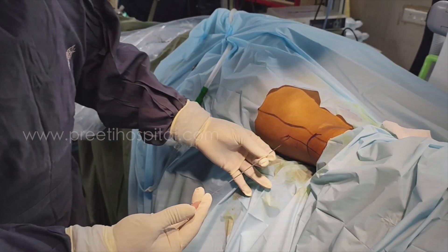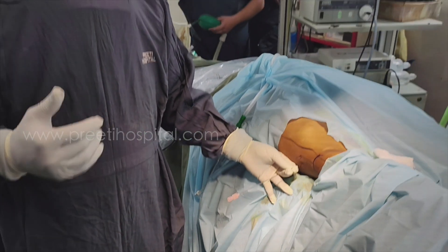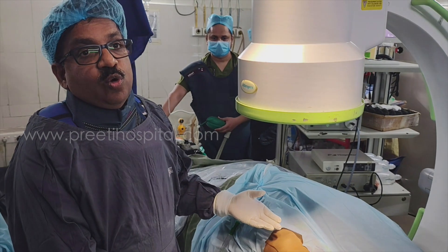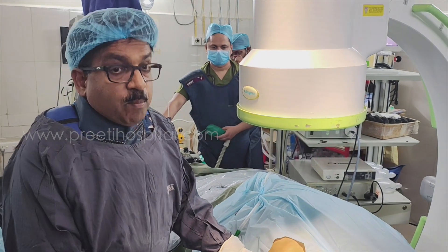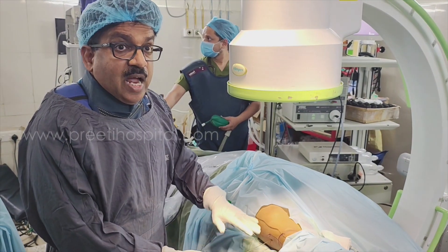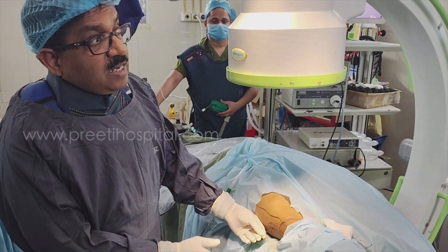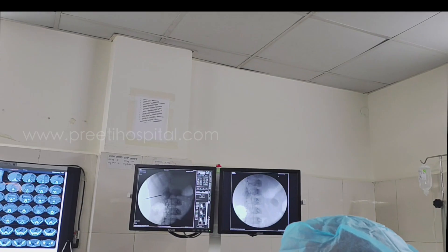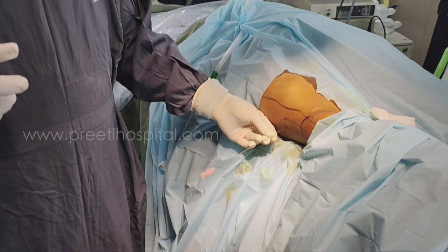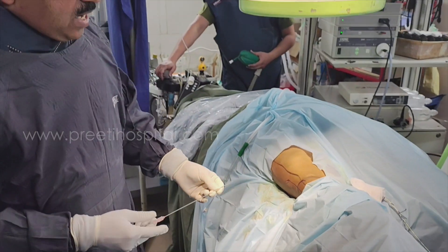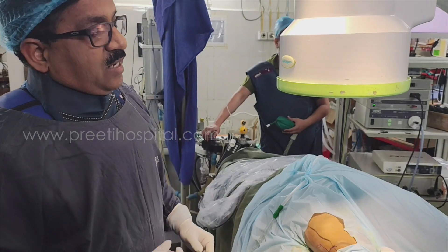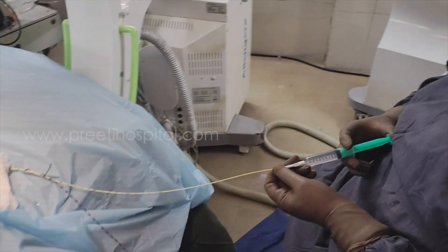Without RGP, you should not do the puncture. Now I have marked and decided one centimeter below the rib. Now you inject contrast. A lot of contrast is going down because of previous history. Now see — the total story has changed. That is why marking should never be done before contrast injection. This is the correct puncture point. You agree? Now my puncture line has gone a little down. Is it good or bad? Good.